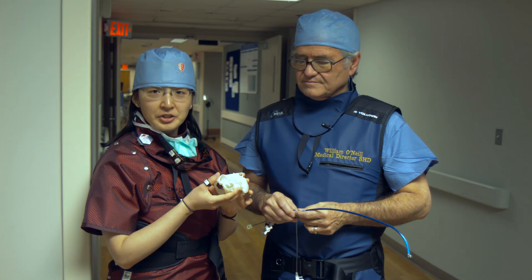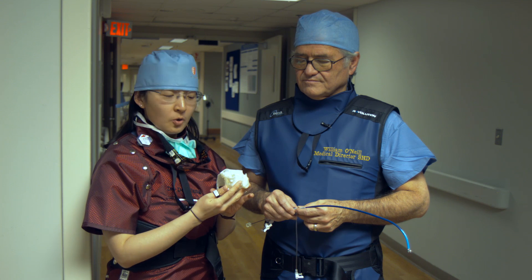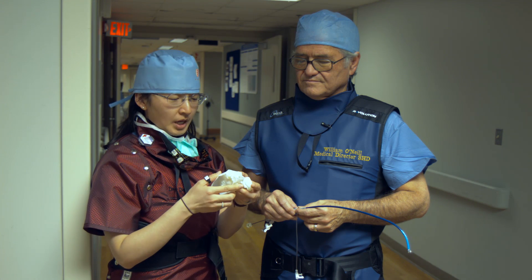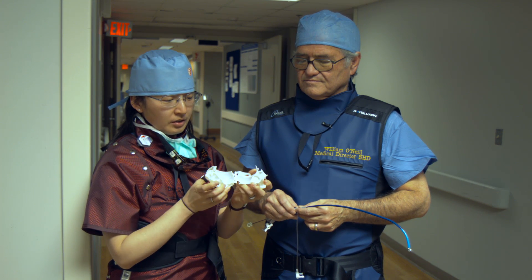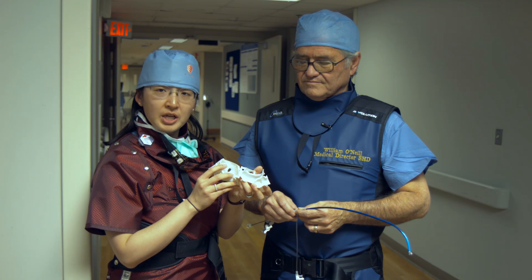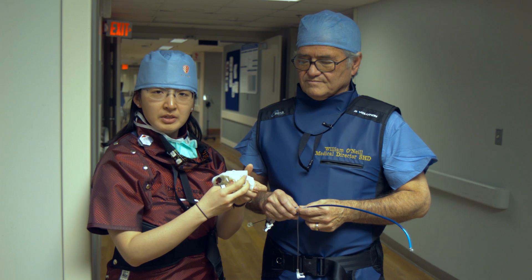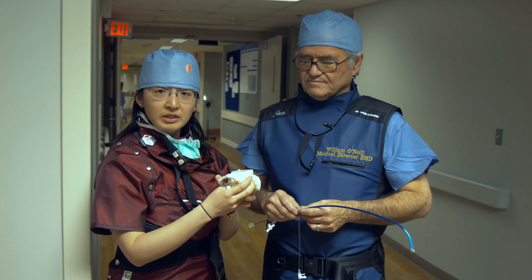This is our patient Ms. D. This is actually her personalized heart — it's a 3D print that we made over a week ago when she was at home waiting for this procedure. We have a CT scan and we can take a look at her left atrial appendage right here. We're going to test drive a device in here before she actually even comes into the case. We can fit and pick our catheters before the case actually begins to help improve patient safety and patient outcomes.